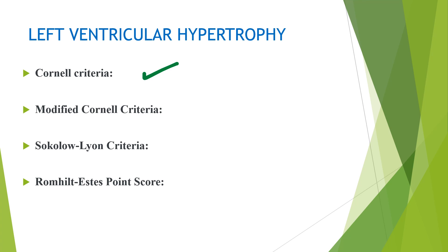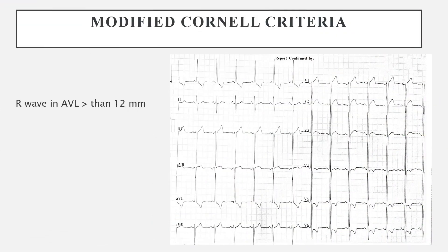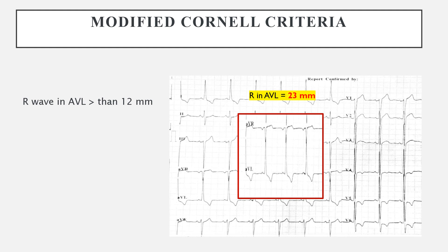Let's move on to the modified Cornell criteria. This is a simpler criteria because we just have to look at one thing: the R wave in AVL. If the R wave in AVL is more than 12 mm, this criteria fulfills the features for left ventricular hypertrophy. Applying this to our ECG, the R wave in AVL was 23 mm, which again fulfills the required value for the modified Cornell criteria, meeting the threshold for LVH.